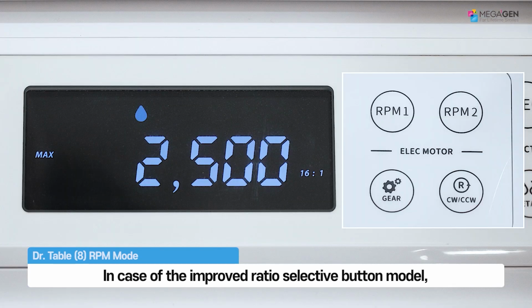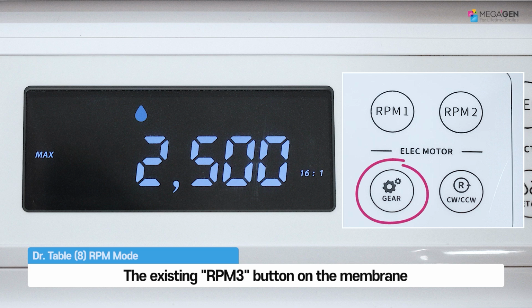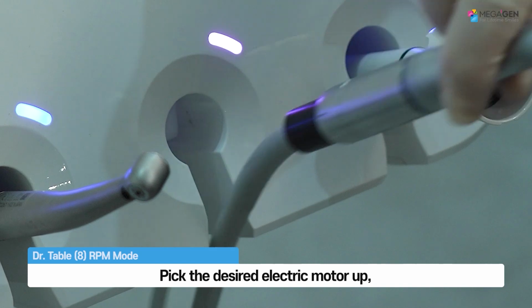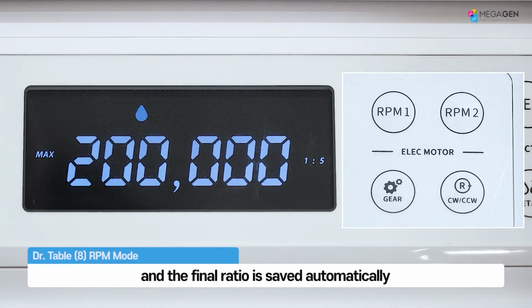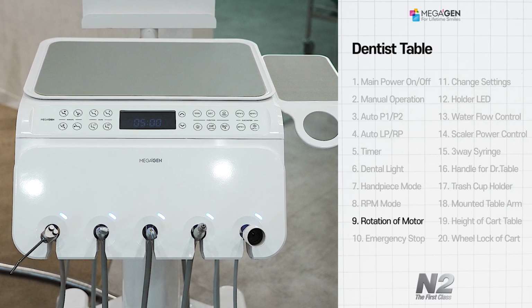In case of the improved ratio selective button model, the method of ratio selection differs from the previous model. The existing RPM3 button on the membrane is changed to gear button. Pick the desired electric motor up, press the gear button to change the desired ratio, and the final ratio is saved automatically.